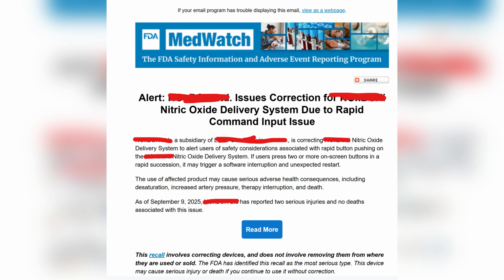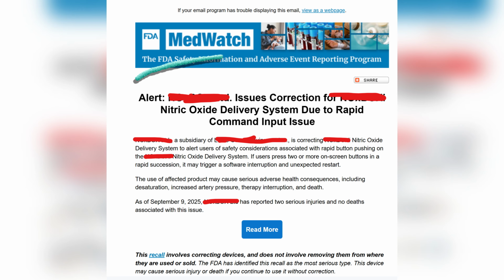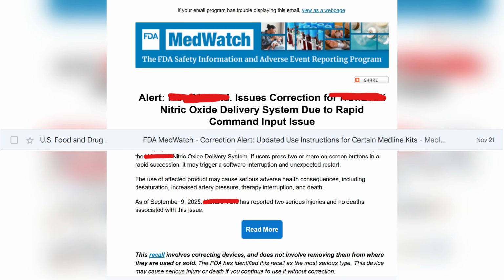Okay, so a couple of things that changed from last time is the FDA has since issued the correction from the last recall we were discussing. But that's not why I'm showing you guys my inbox again, because I wanted to show you guys another correction. Since I made that short, before I could get around to making this long video, the FDA has issued an alert for a correction directly related to usability again. And in this one, the correction is an update to the use instructions.